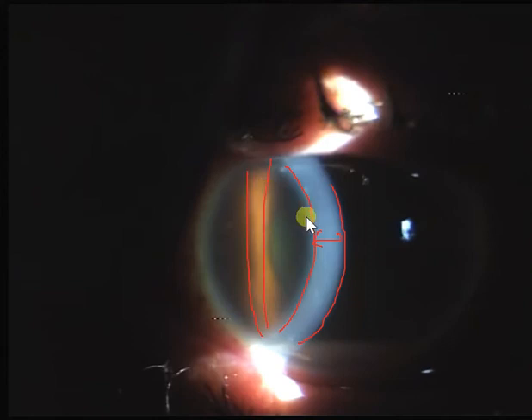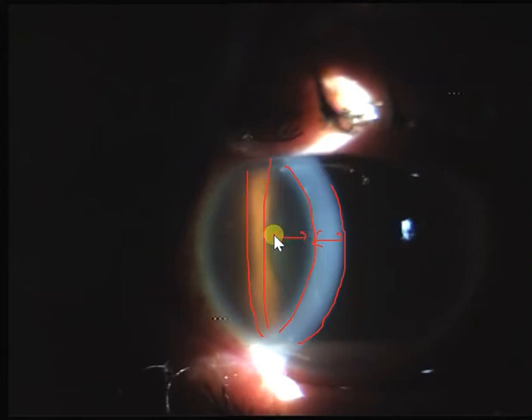You can see the posterior beam on the surface of the iris as a broad beam as well, and this is the area where you look for cells. Obviously this patient is going to have flare, which you can see as a line, and then you will have cells floating in this area. When you have a hypopyon you're going to have plus-four cells and dense fibrin in this area. Don't forget to mention the dilated pupil and whether any posterior synechiae are present.